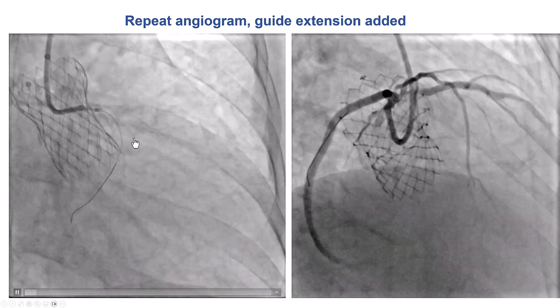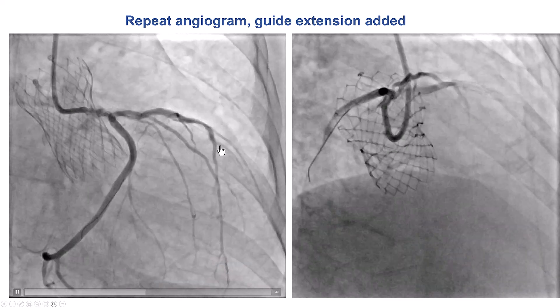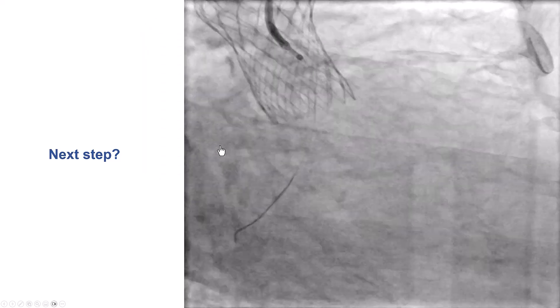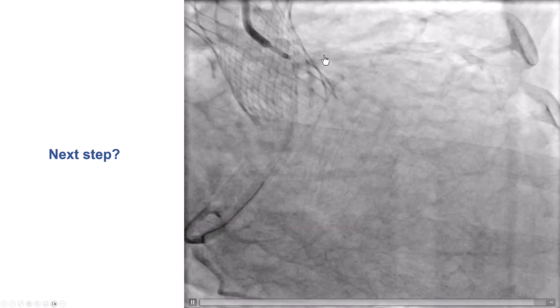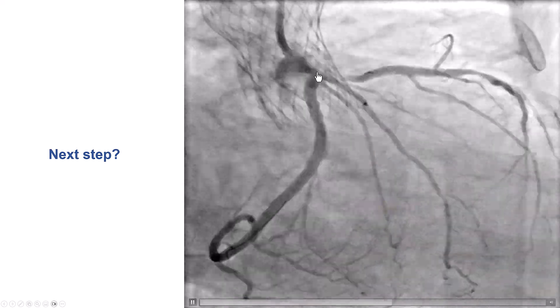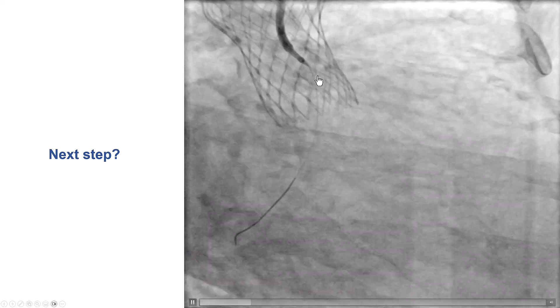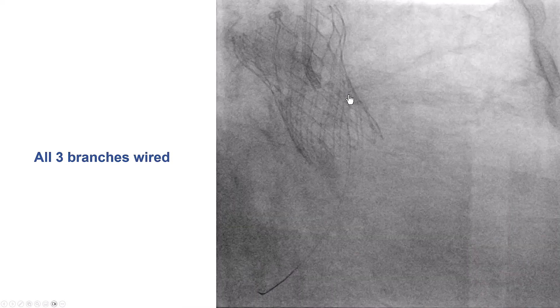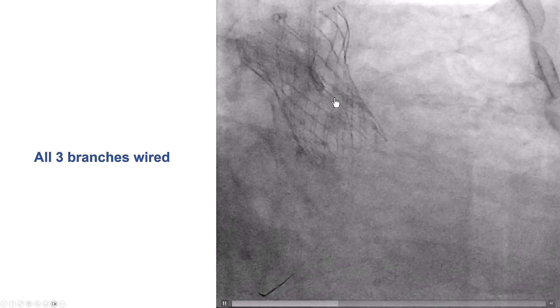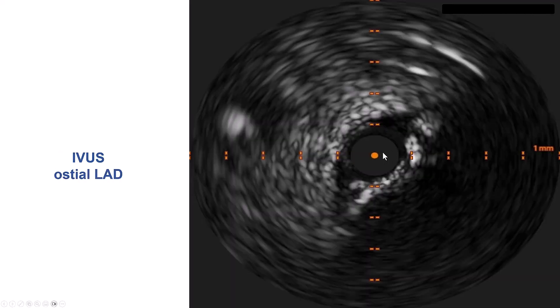We also have some distal left main disease. The circumflex appears to do well, and the previously placed stents in the LAD seem patent without significant restenosis. Another image confirms a very high-grade lesion in the proximal LAD. The left main is diffusely diseased with not much disease in the circumflex. This is actually a quadrification: we have the LAD, the circumflex, and two Ramus branches. We acquired the LAD, the circumflex, and one of the Ramus branches. Intravascular ultrasound demonstrated calcification of the proximal LAD — approximately 180 degrees, not circumferential.